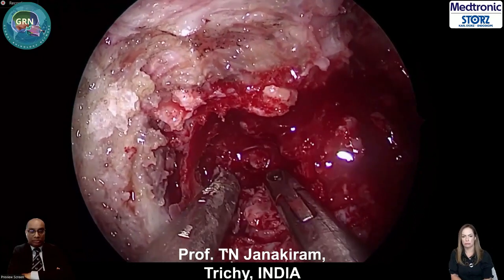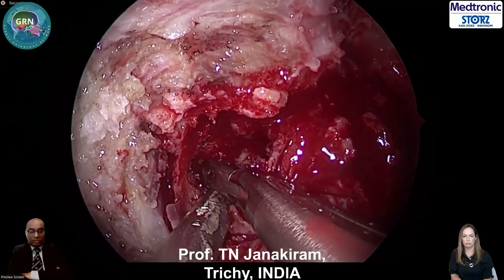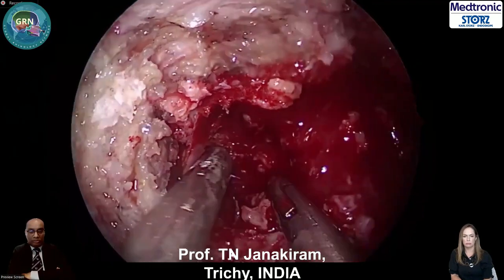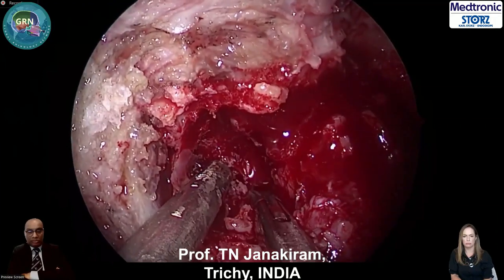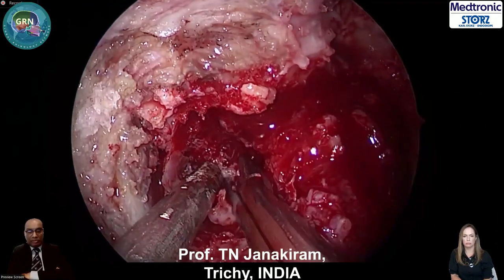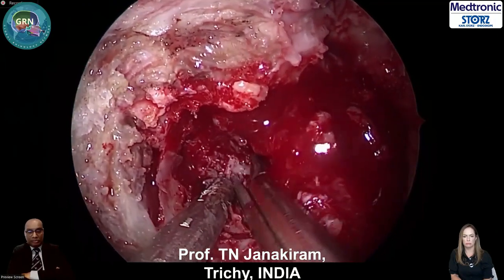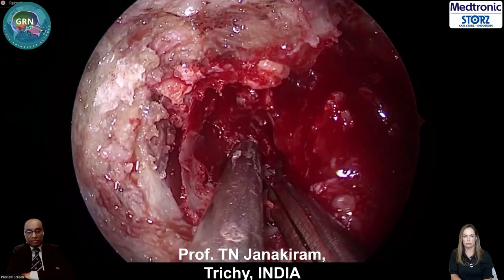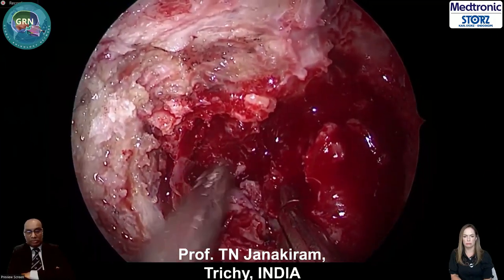That's it. Now, if you have a bleed here, what do you do? You just have to place a little gauze piece and just carry on. That's it. Now give me a small gauze. Now can you see that? Now I'm removing that from all the crevices. Of course, a little is being left behind. Don't worry about that. Why? Because I'm going to drill all that later. A little fibroid, sir. Yeah, it is.